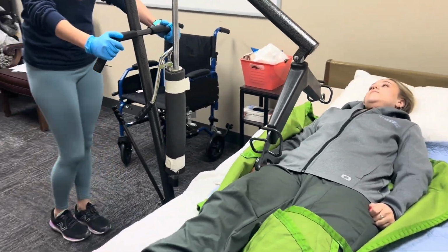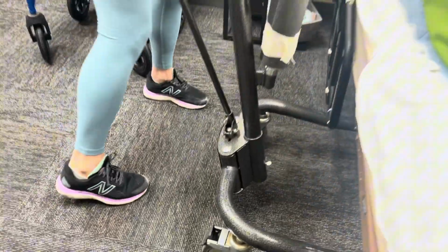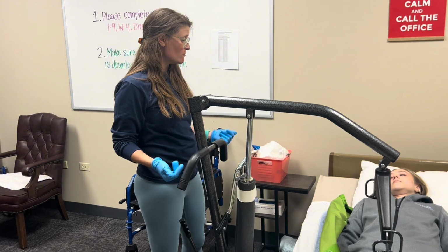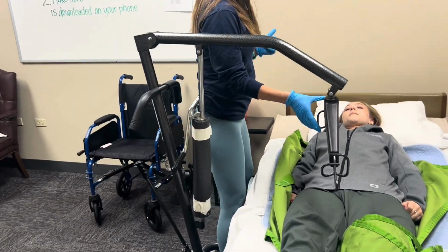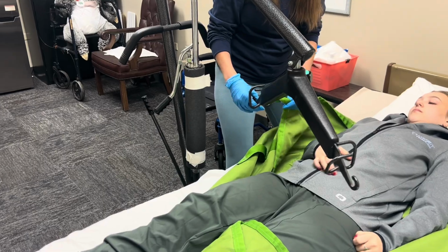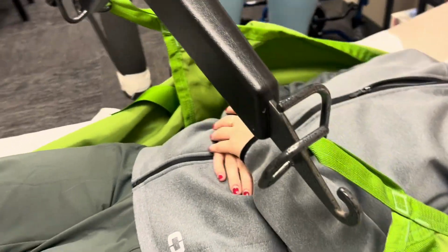Now, the most important part with using a Hoyer is making sure that the brakes are engaged. So my brakes are on before I do anything else. I did not have to change the positioning of the legs because it was able to fall perfectly underneath the bed. So what I'm going to do now is take the Hoyer sling and put one top loop on each side. So the top loops are accounted for.